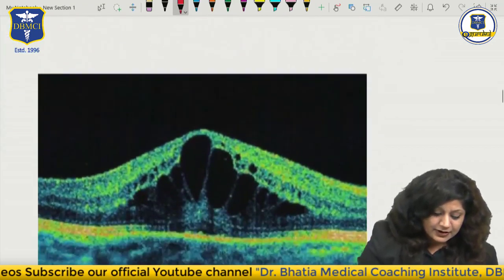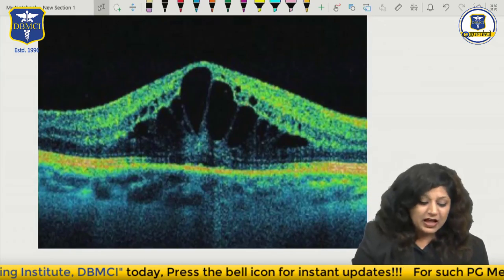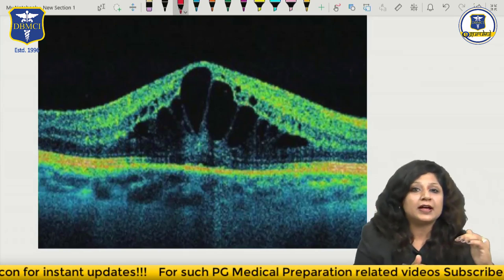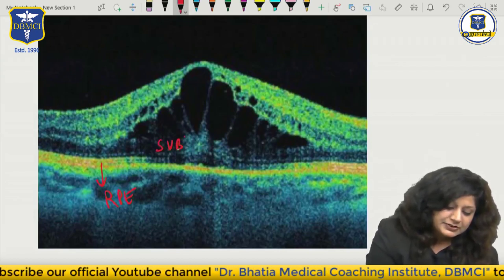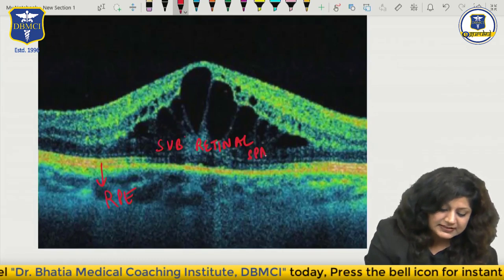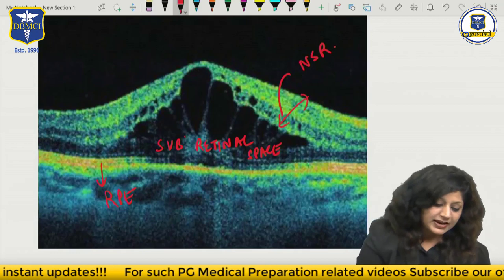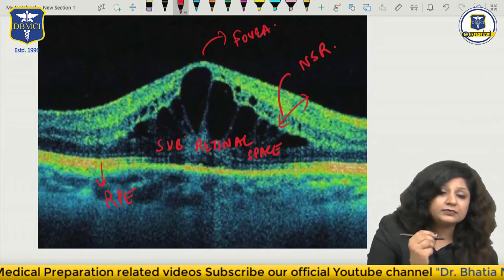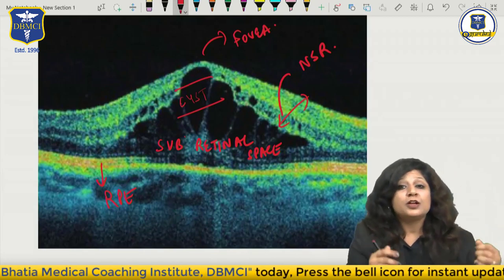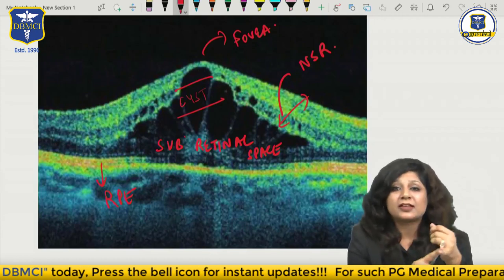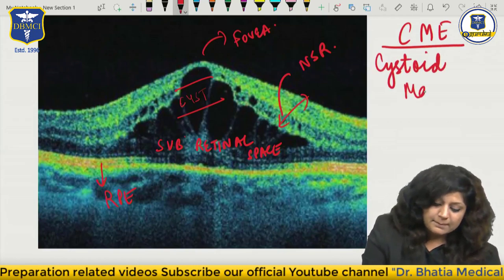Now see this one - sometimes you can get this OCT also. Let us try to analyze it. This red one is again the RPE layer. This black area will be the subretinal space having the subretinal fluid. Then this is the neurosensory retina, and this will be the area of fovea. Now can you see these cyst-like spaces present in the macular area? Because you are having cyst-like spaces in the macular area, therefore this is CME - cystoid macular edema.